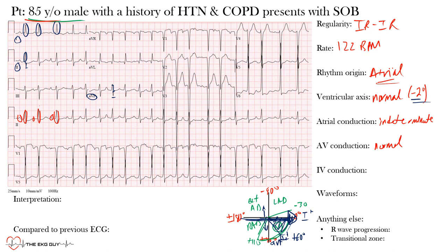For intraventricular conduction, the normal QRS duration in adults is 70 to 110 milliseconds. We can see narrow QRS complexes, and the QRS duration was 98 milliseconds, confirming normal IV conduction. Note that the QRS duration will be the same for each beat because everything below the AV node is occurring normally — the only issue is the different atrial origins above.